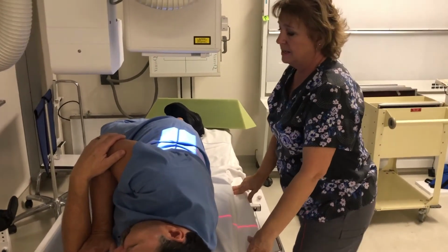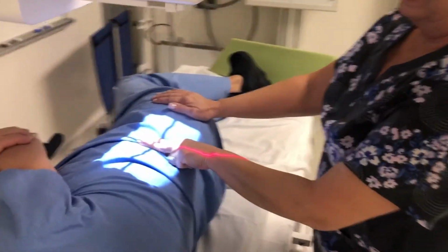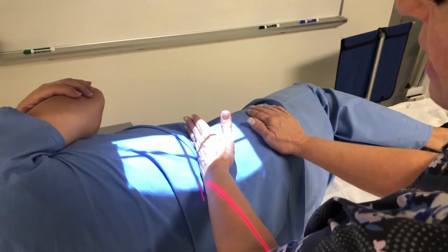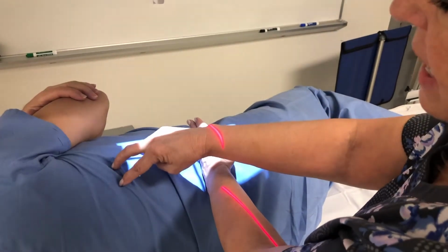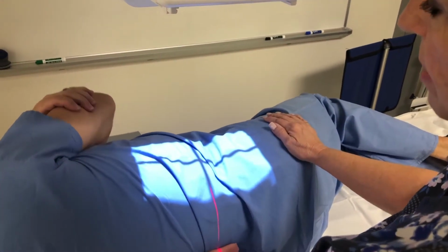Center right on his mid-coronal plane at the iliac crest or 1.5 inches above, depending on the height of the patient. So here's his iliac crest. I'm going to center a little bit high because I absolutely want to include T12 on this, and I want to be on his mid-coronal plane.